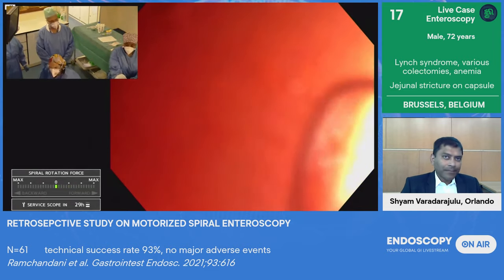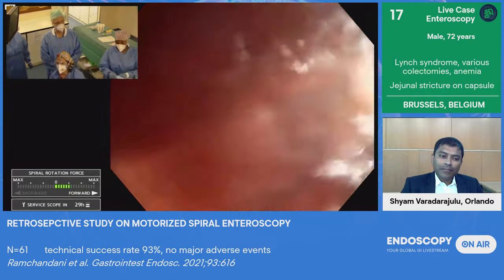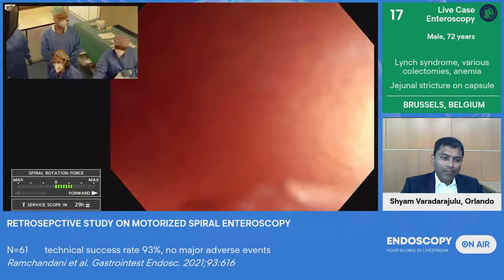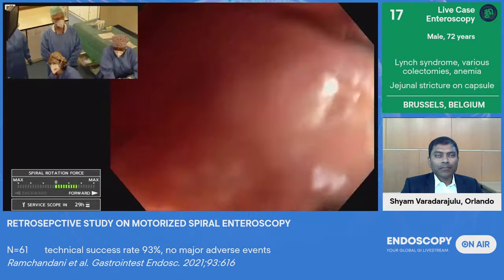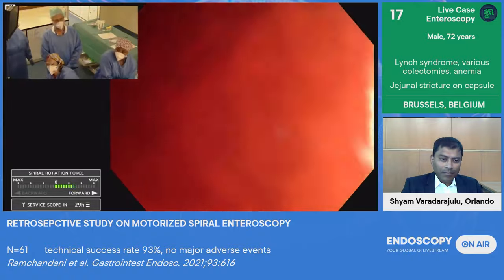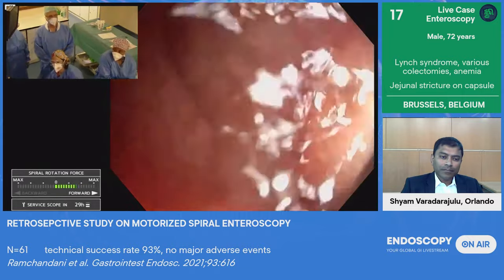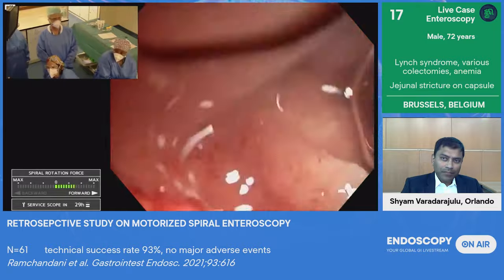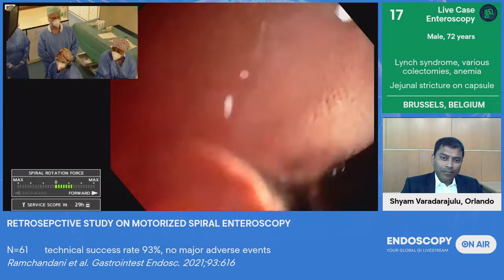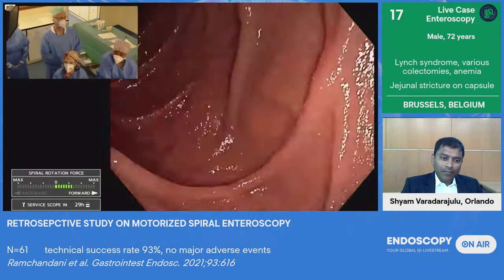The surgical anatomy is an indication where we have some experience. So we have done a few enteroscopies to do ERCP procedures. We even prepared a small movie if you want to see it later on. But it's very difficult to have any conclusion for the time being. It's feasible. Especially in the very difficult anatomy, it seems that we reach the duodenum more often that way than with a single balloon device, but there are no carefully acquired, published data available yet. But this could be a good indication.